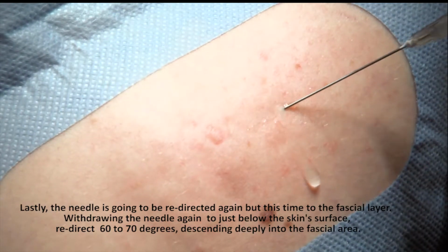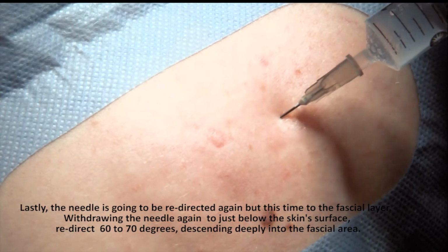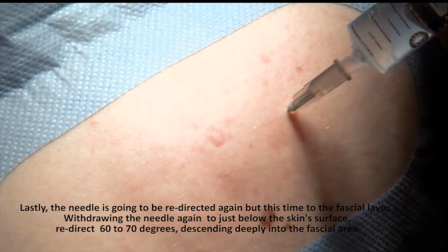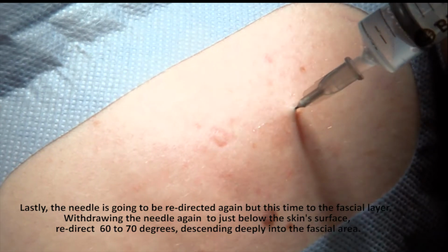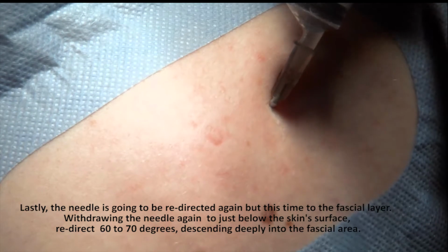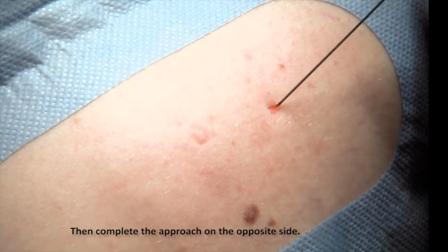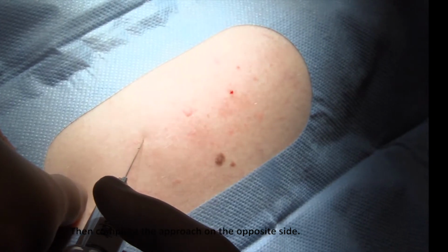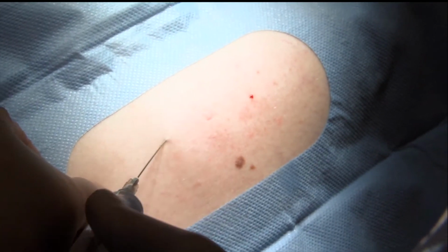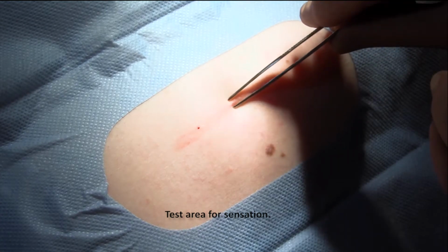Lastly, the needle is redirected again, but this time to the fascial layer. Withdrawing the needle again to just below the skin surface, redirect 60 to 70 degrees, descending deeply into the fascial area. Then, complete the approach on the opposite side. Wait 1 minute. Test the area for sensation.